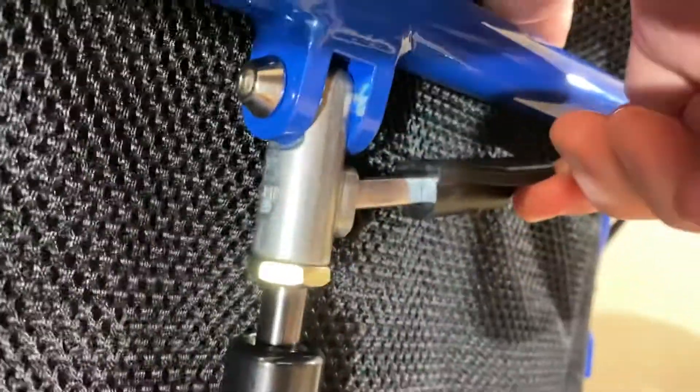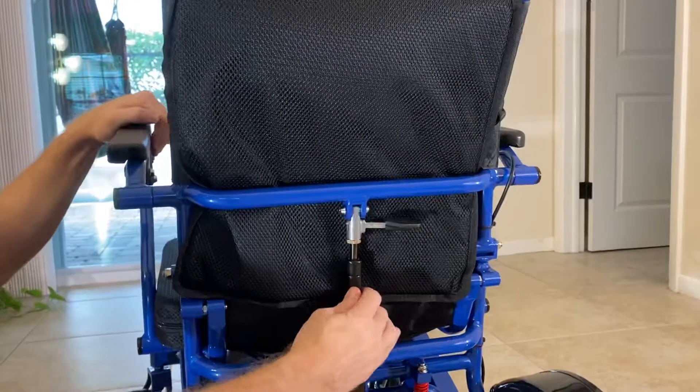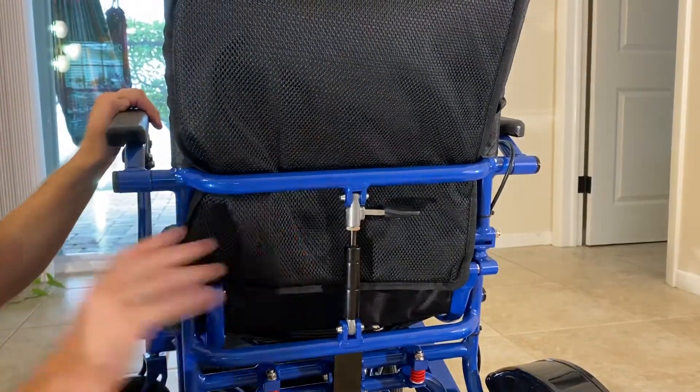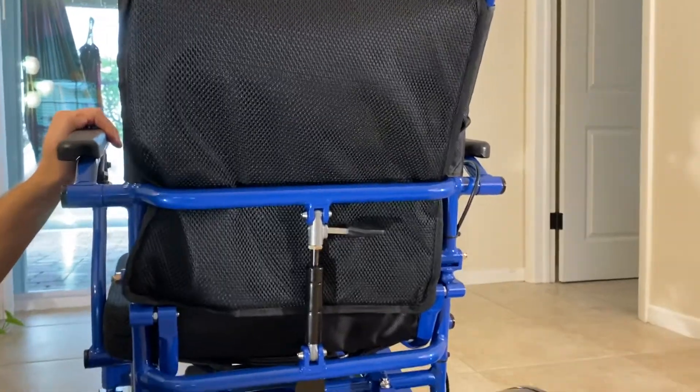Usually you start fully reclined and slowly let the chair up. It's not a sprocket chair, so there are no sprockets — it stops at any point along the way into a fully upright position. That is how the reclining mechanism works on the Falcon. Thank you so much for watching this video.